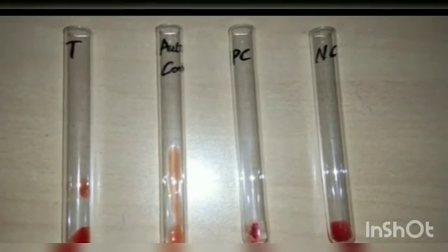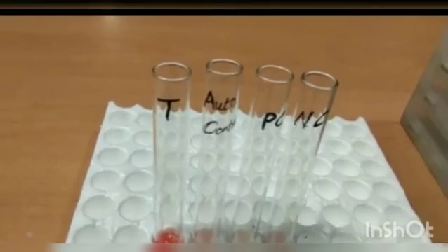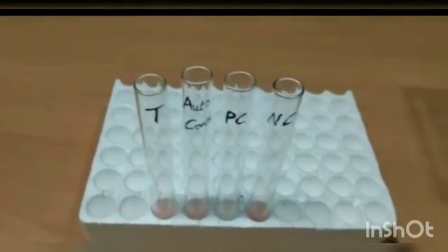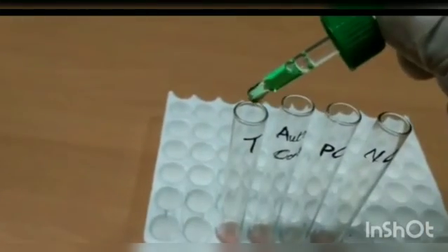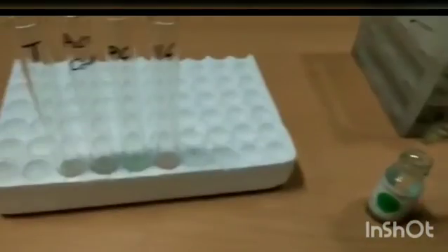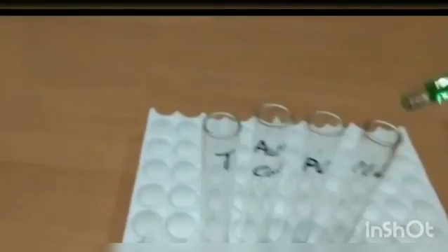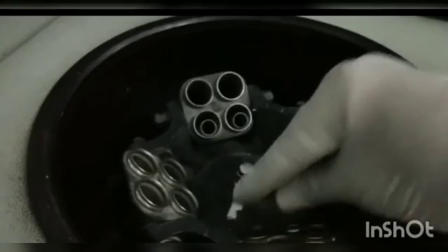In the positive control you can see the agglutination, and no agglutination in the other tubes. So add a few drops of saline to the test and all the tubes, and then add Coombs reagent to the test, auto control, positive control and the negative control, and then you have to centrifuge it at 1000 rpm for 1 minute, and then observe for the agglutination.